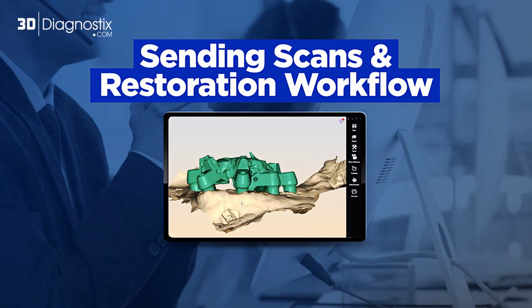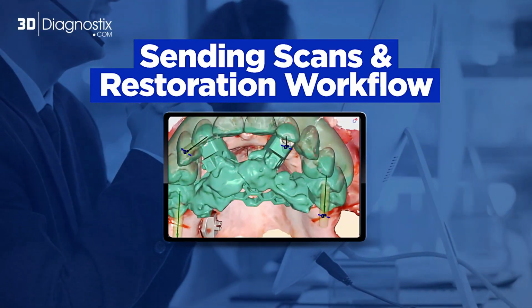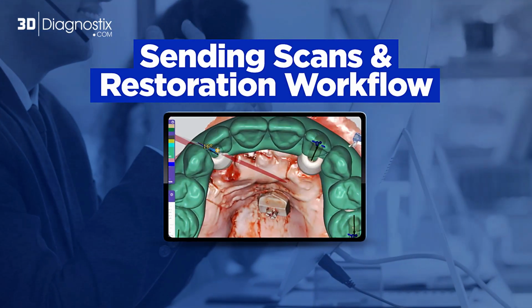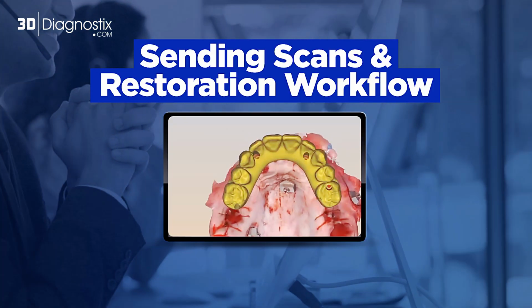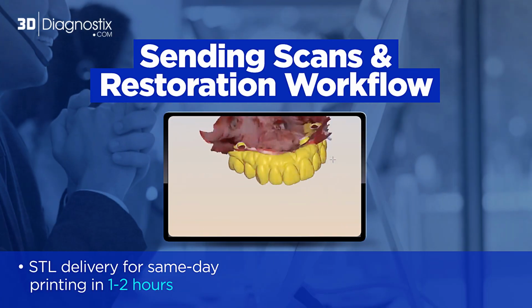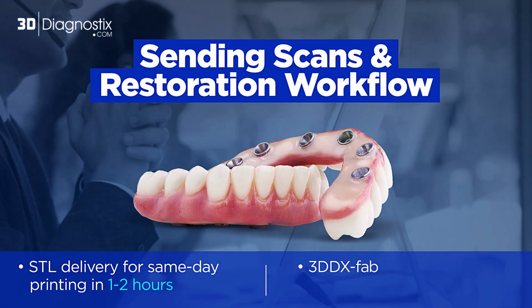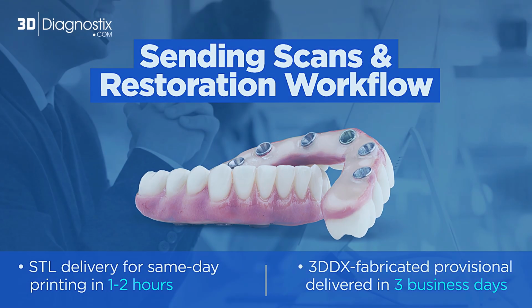3DDX team must confirm that all scans have been received at the required quality to align and finalize the temporary restoration design. A screw-retained temporary prosthesis will be fabricated either in your clinic in 1 to 2 hours if you have a 3D printer, or 3DDX can fabricate the restoration and deliver it to your doorstep in 3 business days.